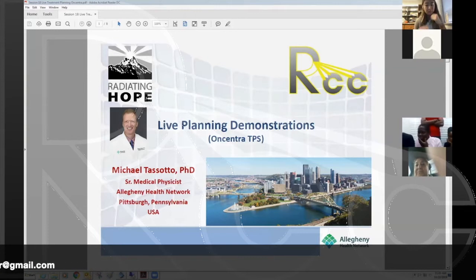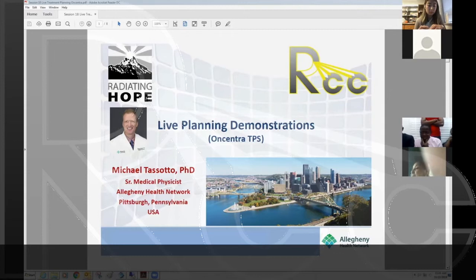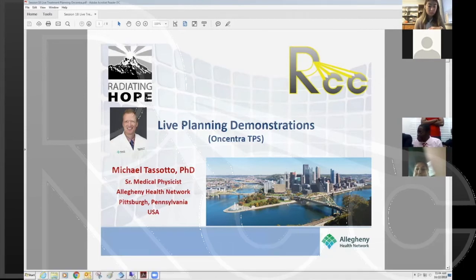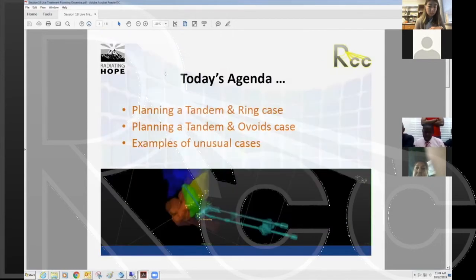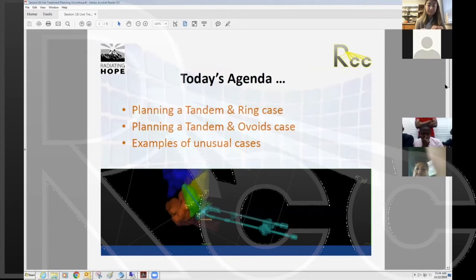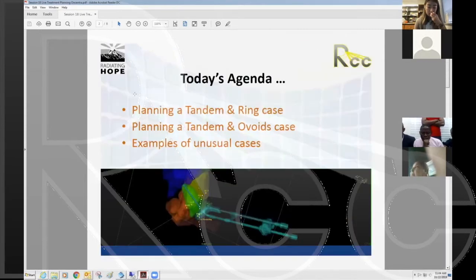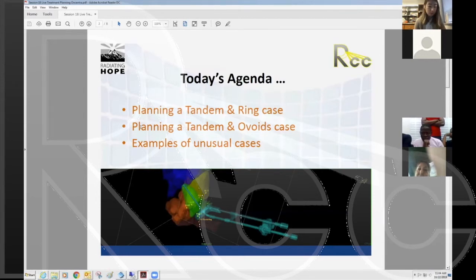Last week you heard from Derek and Dan regarding Varian's BrachyVision and how to navigate and plan tandem-and-ovoids and tandem-ring cases. I'd like to do something similar today for Oncentra brachytherapy planning. I'd like to kick off this webinar with a tandem-ring case followed by a tandem-ovoids case, and hopefully we have some time at the end to talk about some unusual cases.